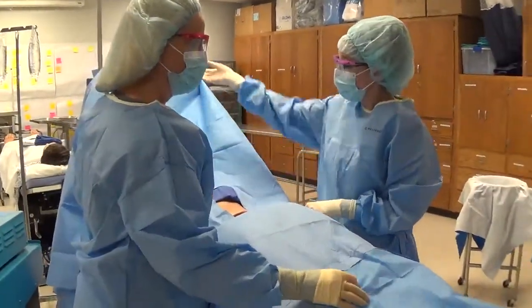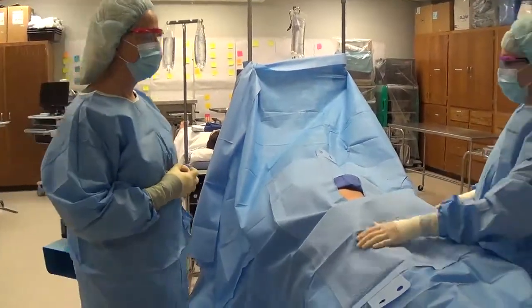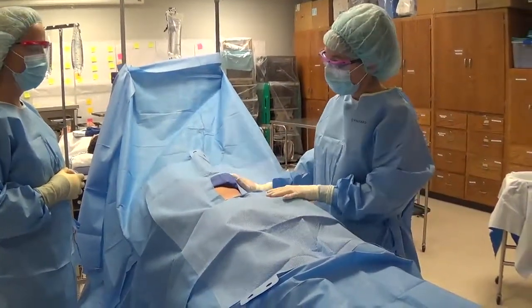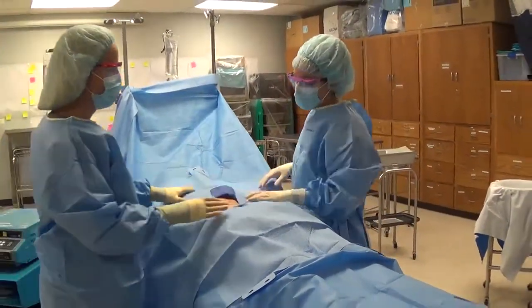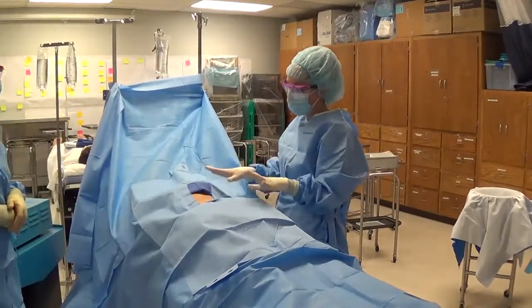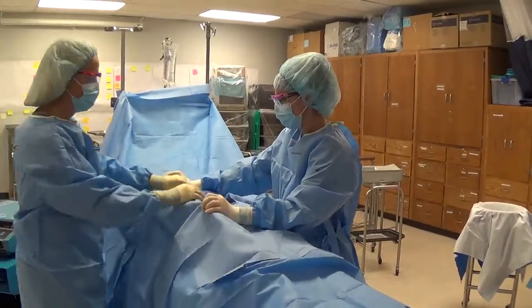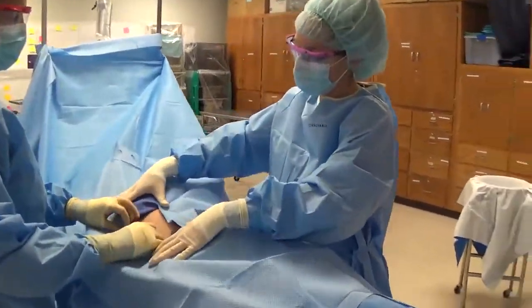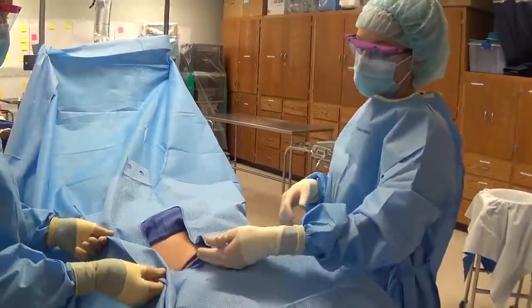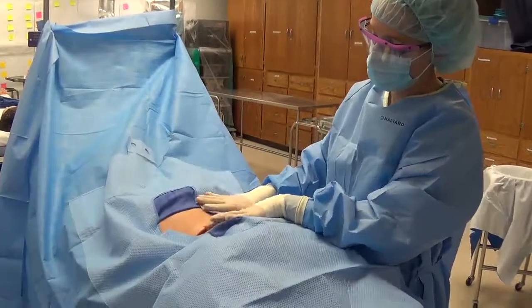If you do get your hand contaminated up there, with two pairs of gloves on you can take off the outer pair and get a new one — another reason we wear double gloves to correct contaminations. If you didn't remove the adhesive, place a hand to prevent the drape from shifting. If the drape shifted so you couldn't see the incision site, you can't pick the drape up and shift it back — that brings something unsterile up to a sterile level. Instead, just cut out that section to give access to where you'll make the incision.